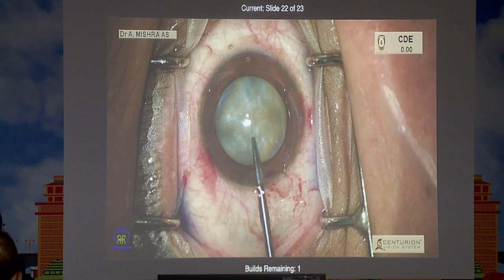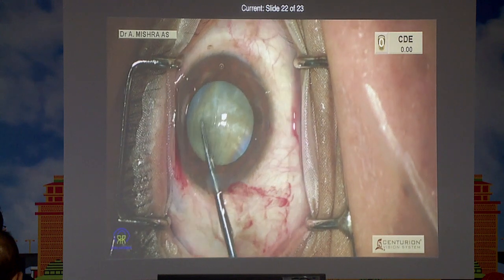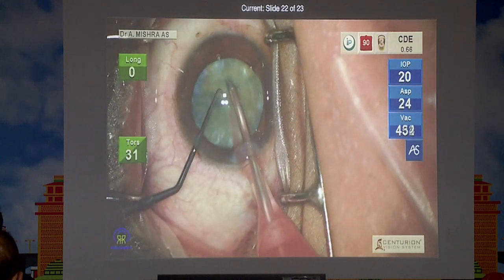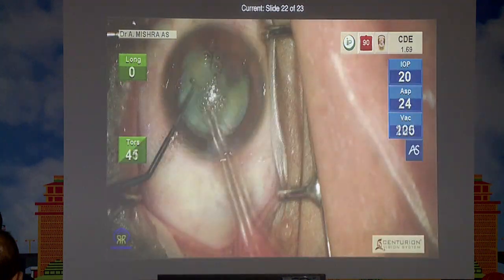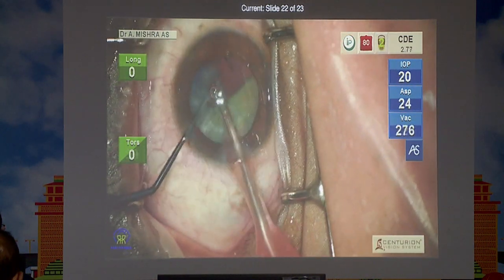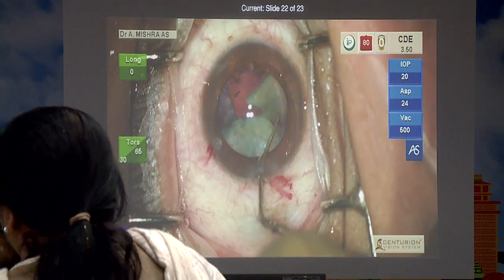This is another case wherein the behavior was similar. It was also intermittent, but the rhexis did not run out in this case. However, while I was doing the case, something happened for which I just received a jolt and I thought something was wrong. As I was removing the second piece, look at that, just carefully look at that. This is how the PC behaves. It blobs and you know that you have touched it somewhere.